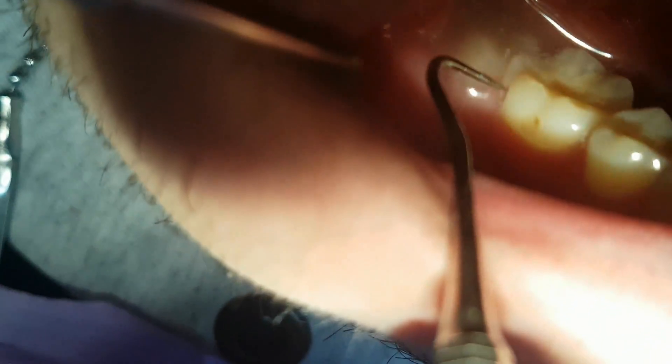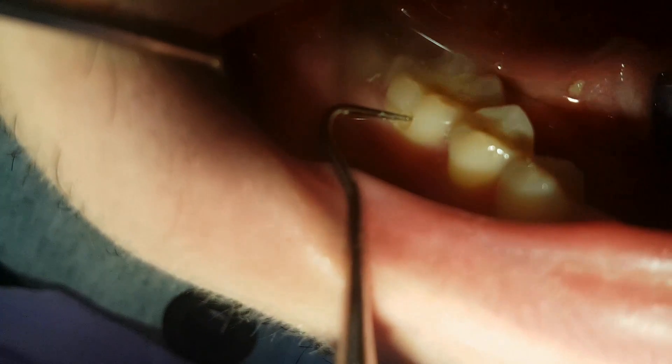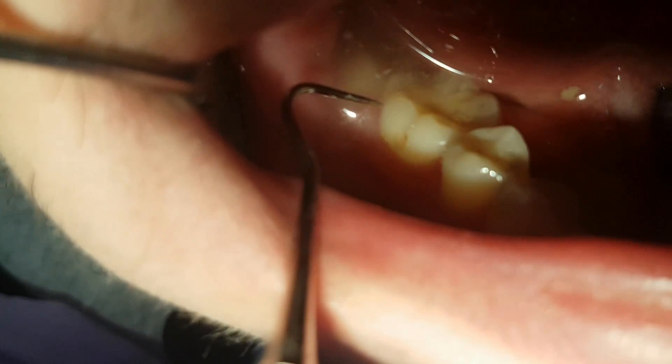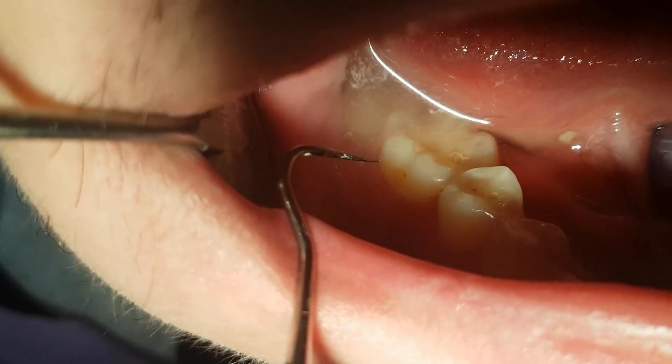Glass ionomer cements have the characteristic to bond with the dental tissue, allowing us to preserve the hard tissues of the tooth.